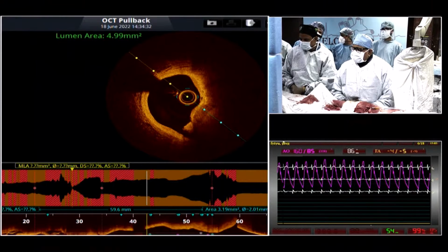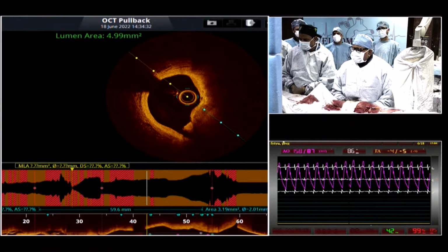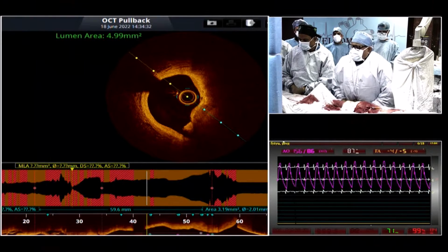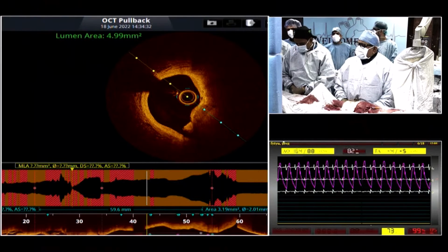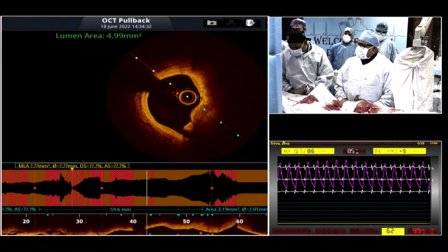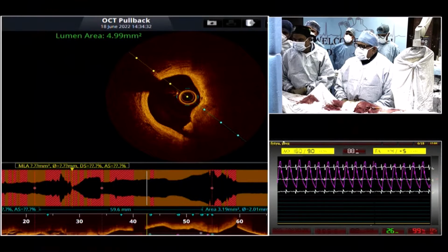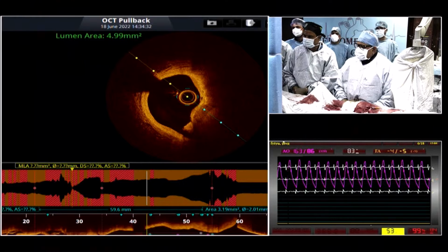I think there's a problem of a calcific nodule. We don't have a standard thing to address it, possibly. Off-label IVL can help. Okay. For a calcific nodule, IVL off-label use is there. So there is a difference of opinion here. Some people want to just stent it. Some people want to use IVL. But if I have to do it, I will upsize the burr. I will straight away go with a 2 millimeter burr. It's a very large size artery, and I would do just a little bit more debulking and cut away this nodule, and then see whether he needs any cutting balloon or whether we can go with the stent.